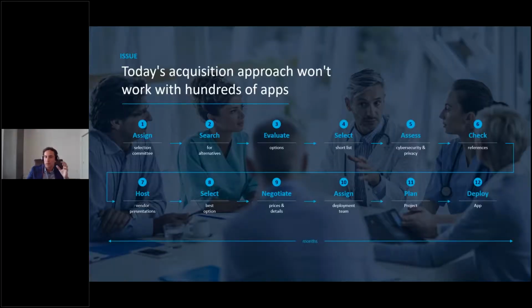And if we look even at the purchasing process that healthcare providers follow today for software or modality acquisition, it's a large number of steps from the time you set up a purchasing committee to the acquisition and finally to the deployment and the adoption of the software or application. It can take months. And this approach just cannot work if we think of dozens of applications that you might be deploying in the coming years.